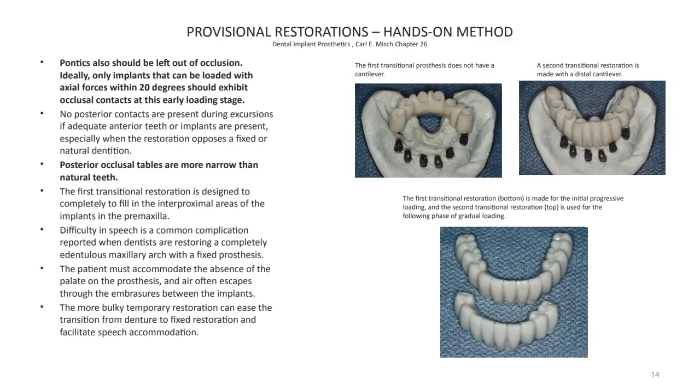We talk about the pontics that are cantilever. So we have to make sure for those cantilever pontics, we leave them out of occlusion. We don't want any pressure, any force exerted over them, okay?